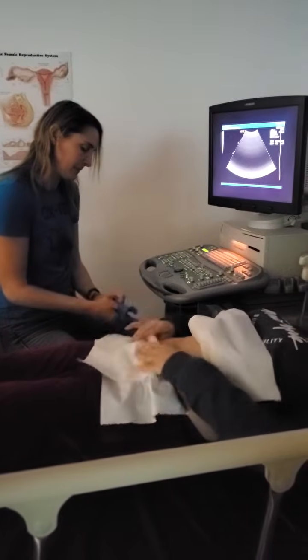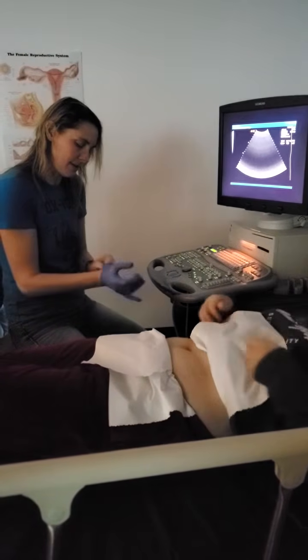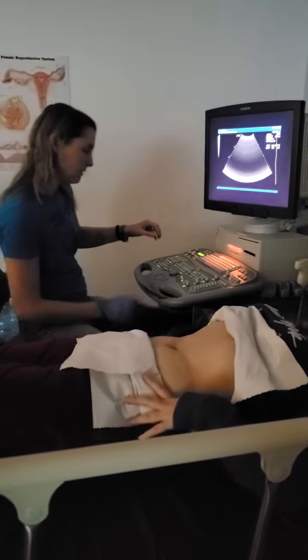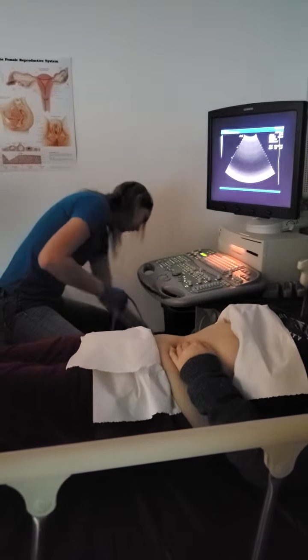Okay. Good, no, after all these years, wet hands and gloves do not fix. What is going on here?